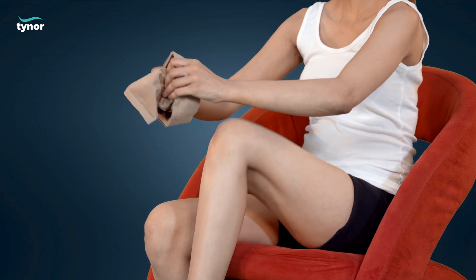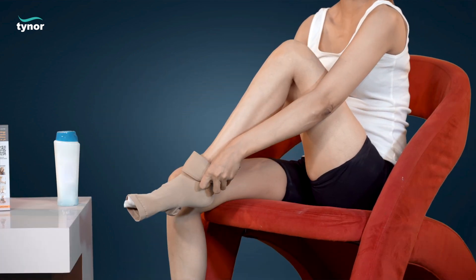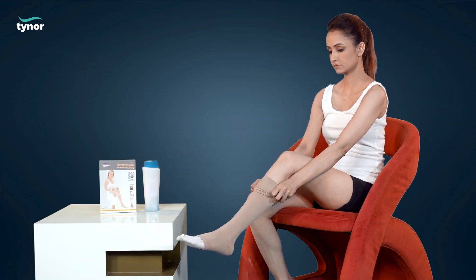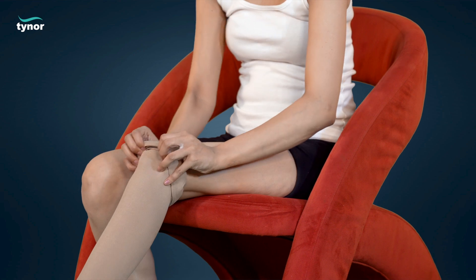Pull until it reaches the ankle, then unfold the compression stocking from the ankle to the knee, and then up to mid-thigh.